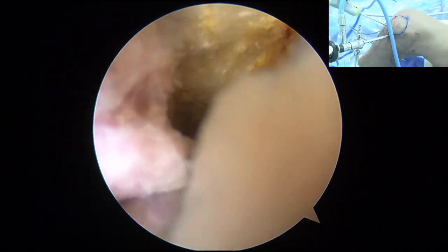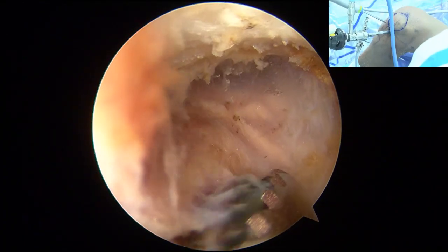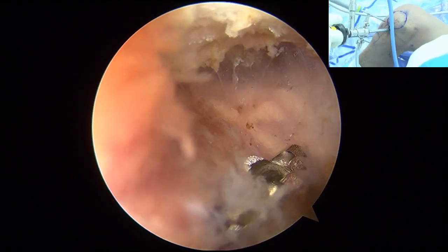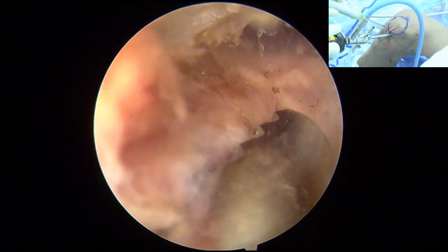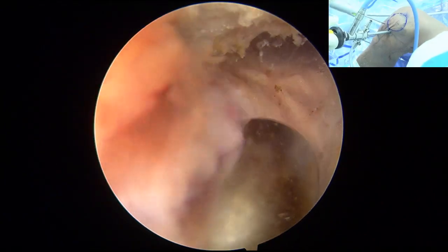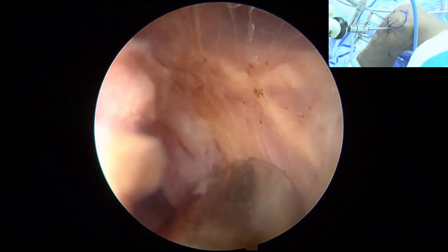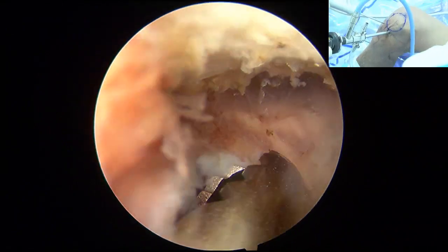And then you go here, you go it deeper, and then you turn your shaver blade to the left, okay? 把刨刀的刀头向左。But not beyond this, not beyond over the top. 但不要超过这个范围。Then I turn my camera like this, look at the left side, the PCL, just behind the PCL, okay? And then you check this soft tissue, we call this the septum. 是隔膜的地方。Now you're cleaning the septum. You're starting to see the hole. You see the holes on the left septum.